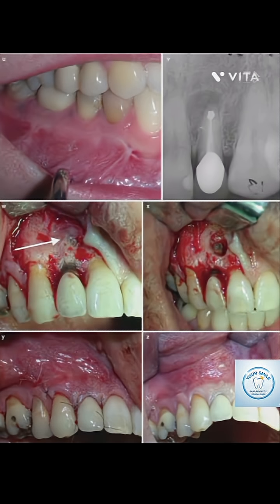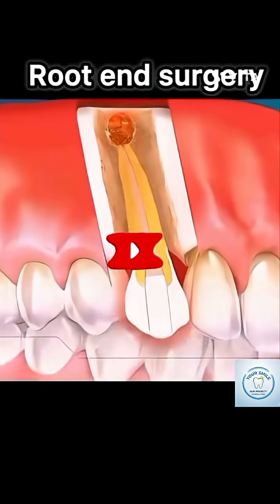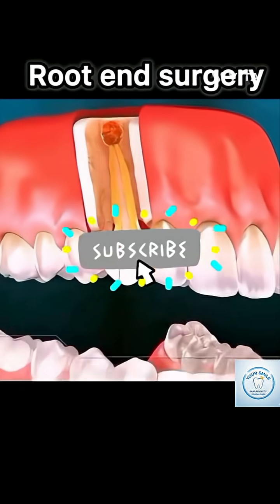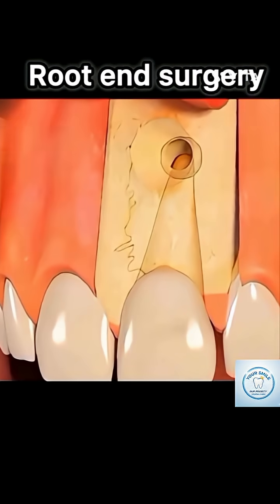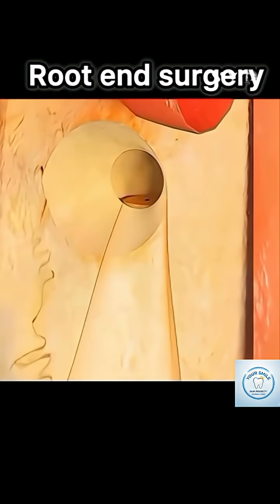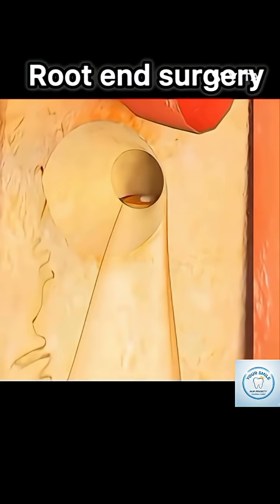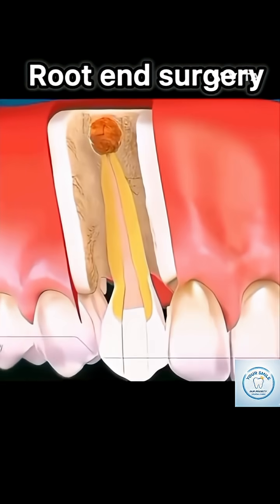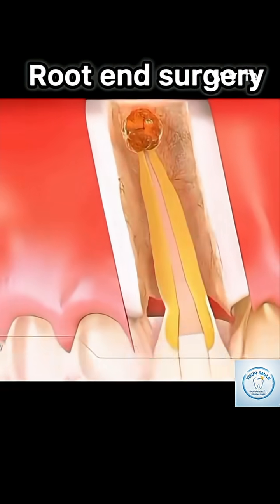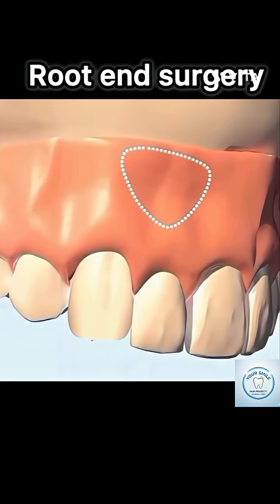Root end surgery, officially called an apicoectomy or root end resection, is a minor surgical procedure performed by an endodontist or oral surgeon when conventional non-surgical root canal treatment has failed or is impossible to perform. The procedure is typically done under local anesthesia and involves several precise steps.